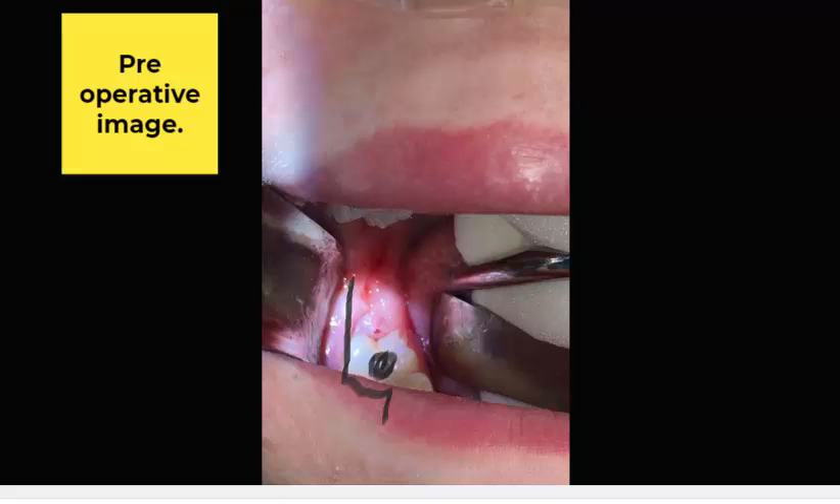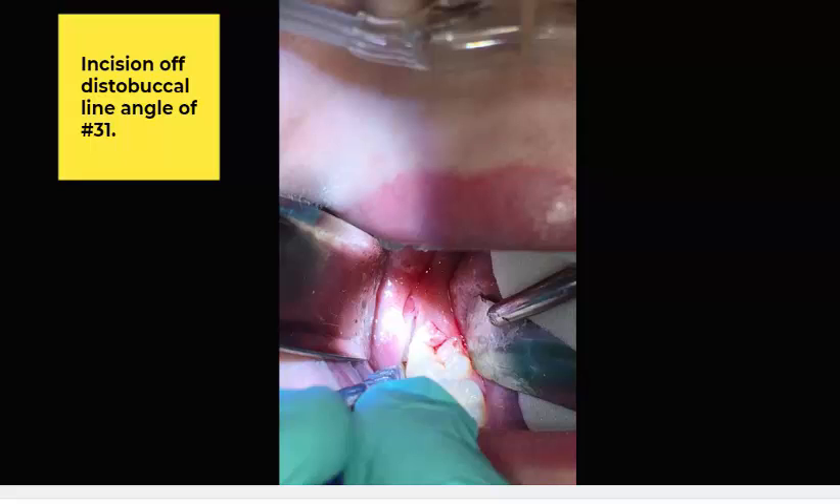I will make a comment about this particular case. There is a little tissue aberration right here — some non-attached soft tissue or mucosa attached right distal to the tooth. It's an interesting little twist on how I typically do my flap design, which is straight off the distal. In this case, I elected to go along this little natural groove to see what would happen. And when I released it, that almost went back to my original intended design, which is straight off the distal buccal line angle of tooth number 31.